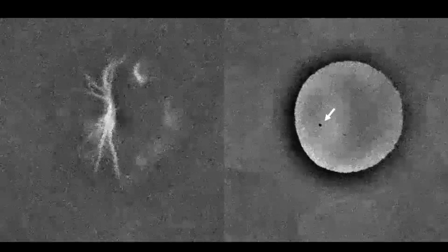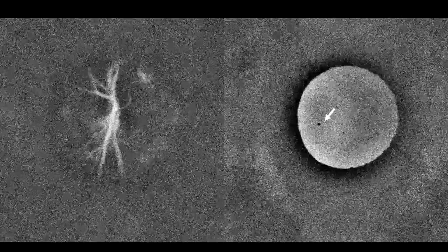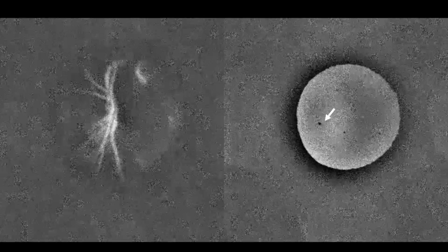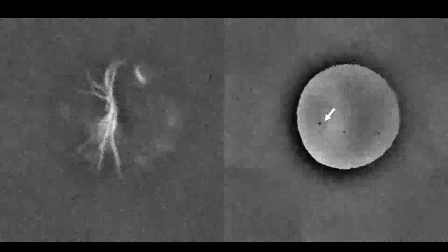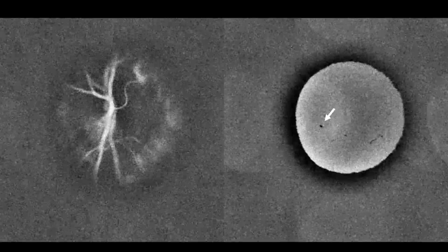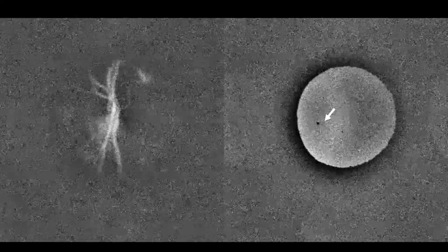And my transition to what comes next is that if you pay attention very carefully to the blood flow movie on the right, you can see that there's a sort of black dust that moves around with the eye, and this black spot looks typically like the dust that we would observe on an optical lens, but because it's moving with the eye, we can know that it's actually not dust on the optical system. Unfortunately, it's something that was located on the eye of the subject.